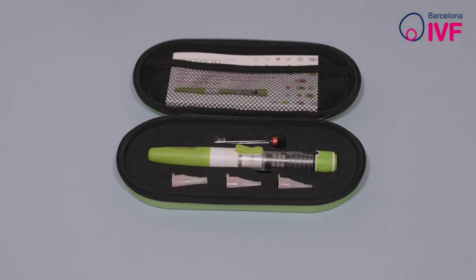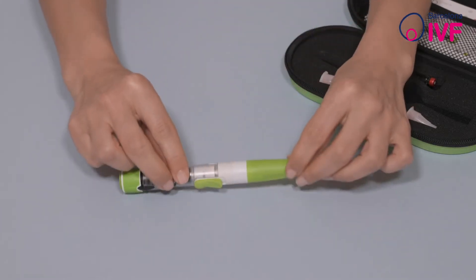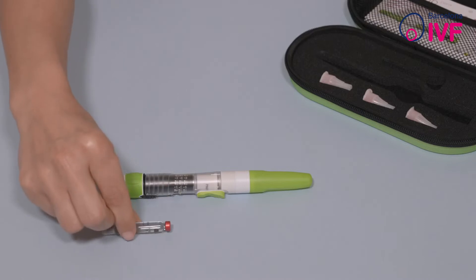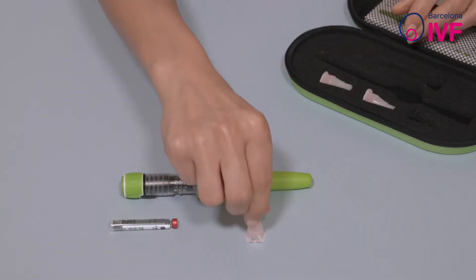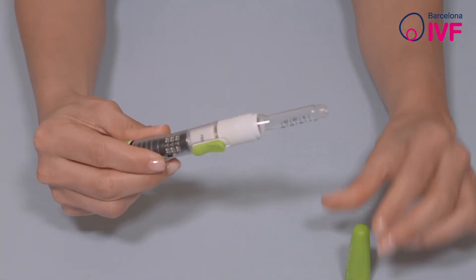Open the box and place its contents on the table. You will see that the kit consists of a multi-dose pen, medication cartridge, and sealed needles. Remove the cap from the pen and unscrew the two pieces of the pen to be able to insert the medication cartridge.